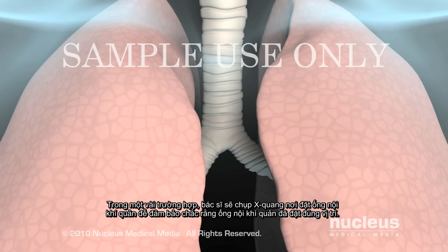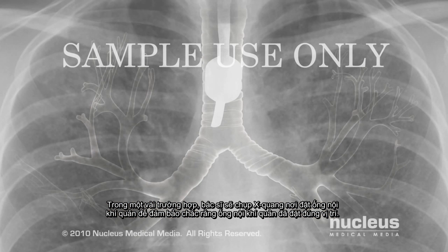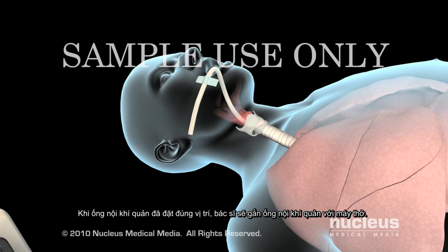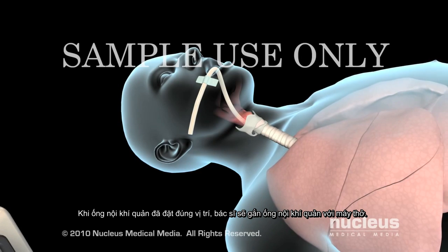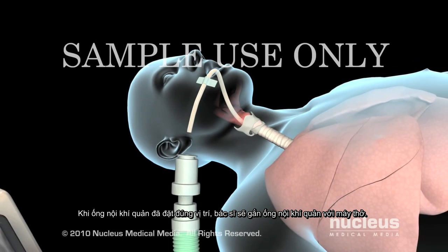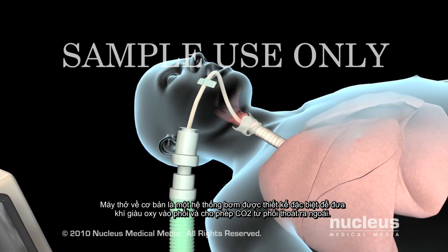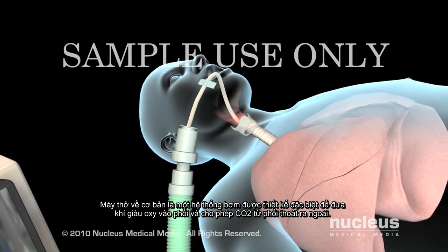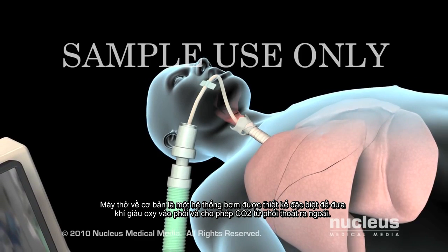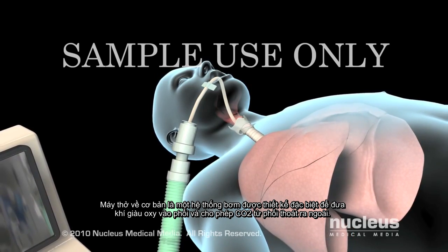In some cases, an x-ray is taken immediately after intubation to confirm the tube's placement. Once the endotracheal tube is in the proper position, your doctor will attach it to the mechanical ventilator — a specially designed pump that aids respiration by delivering well-oxygenated air into the lungs and permitting carbon dioxide to escape from the lungs.